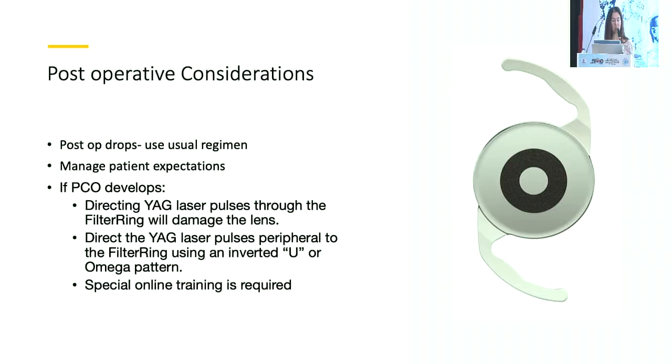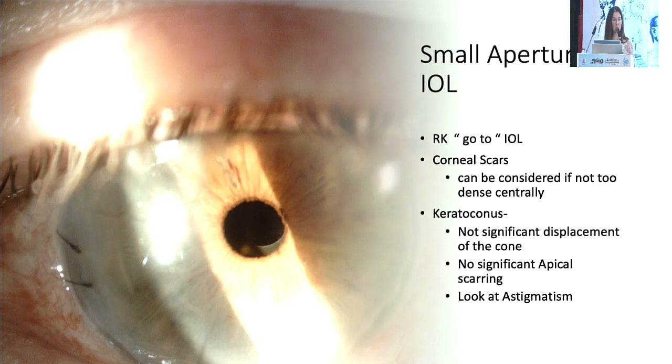Post-operative considerations, again, Jode went through how you do the YAG. You want to avoid that filter zone. There's special online training that you need to take, and I absolutely recommend it. For RK, again, small aperture lenses, it's my go-to. For corneal scars, you can also consider it.